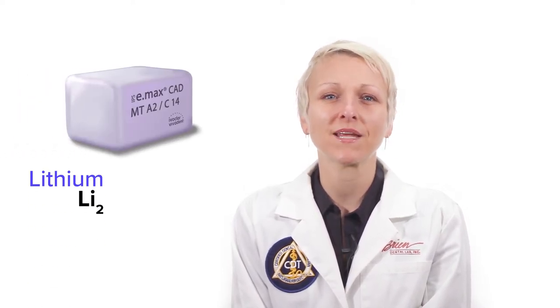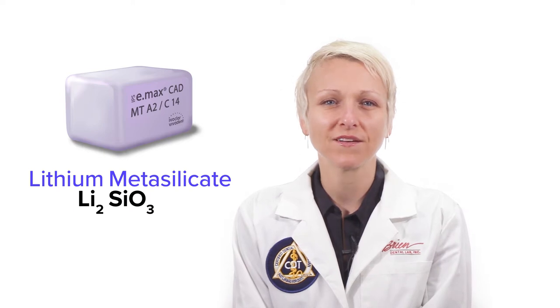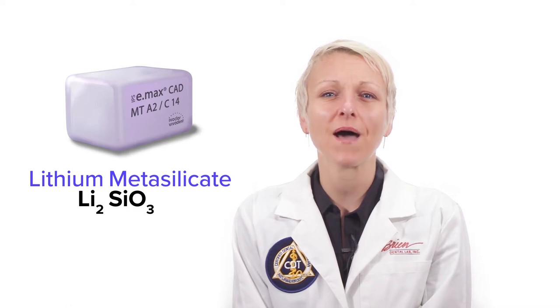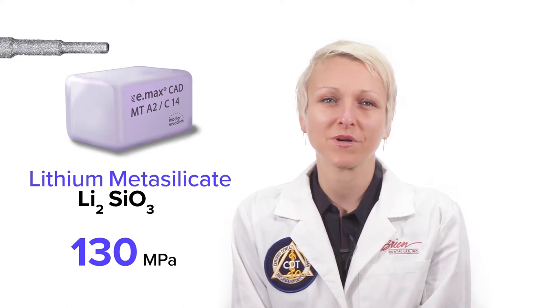To make Emax millable, the lithium disilicate is only partially crystallized at the factory, which creates a material called lithium metasilicate. Lithium metasilicate is blue in color because the shade characteristics are only gained after crystallization. Lithium metasilicate is a lot softer than lithium disilicate and is rated at about 130 MPa of flexural strength, which allows the product to be milled with diamond grinding burrs.